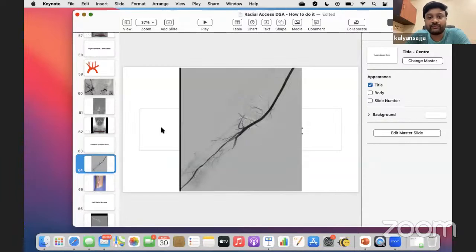And then you can use a 4 French radial, 4 French SIM catheter to do an angiogram. That goes much more pliably into these arteries.